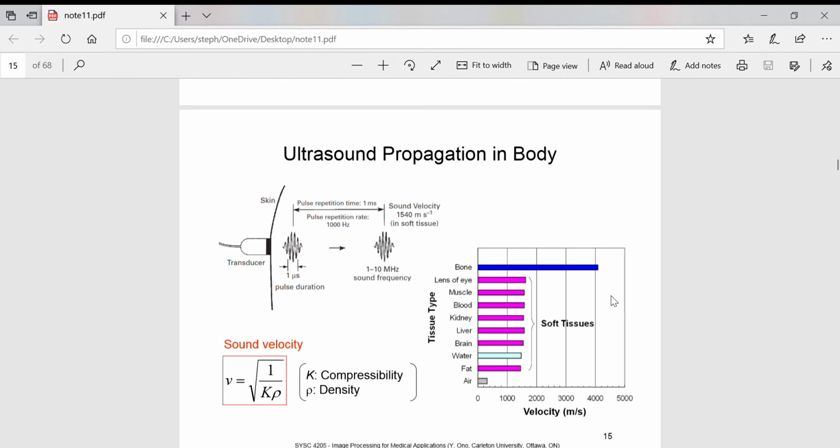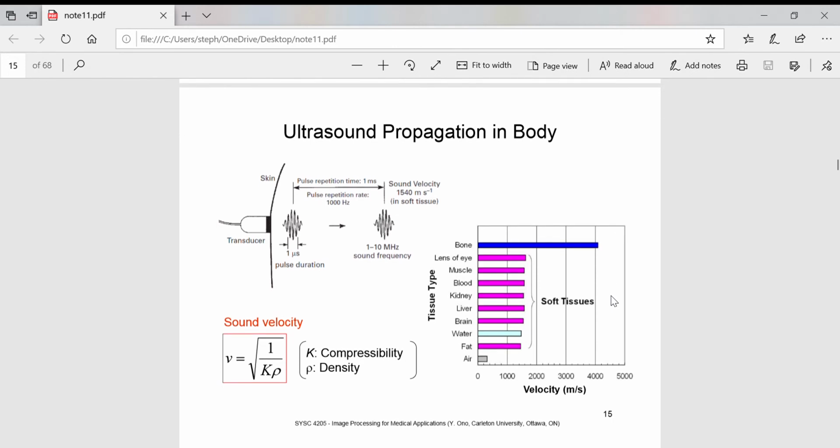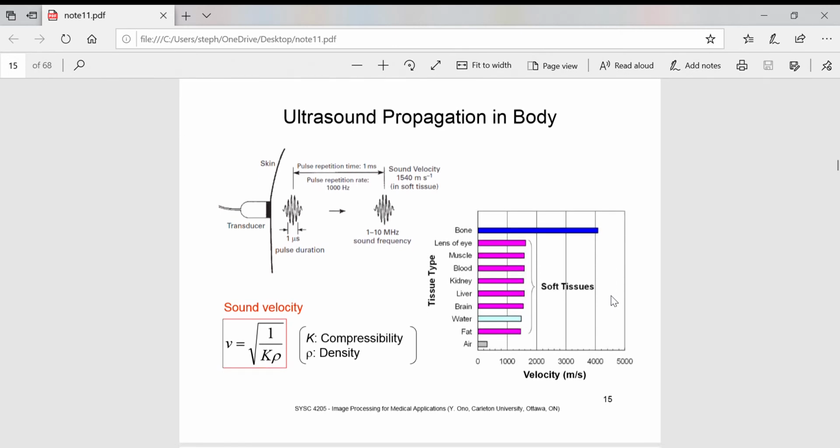Because the particles along a sound wave do not move in synchrony, particles near the origin of the sound wave begin vibrating before more distant particles. So sound velocity is the rate at which the vibratory energy is transmitted in a specified direction of propagation. Velocity is a vector quantity, which means that the direction as well as the magnitude must be specified. When the direction of propagation is not specified, the proper term is speed. So that's generally what we're looking at here, velocity.